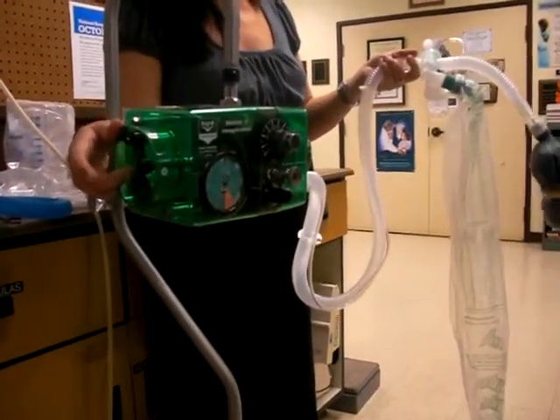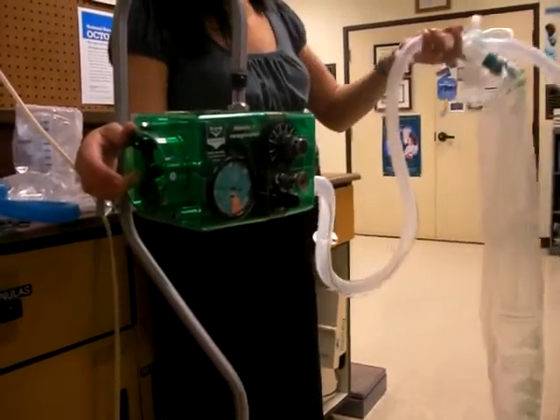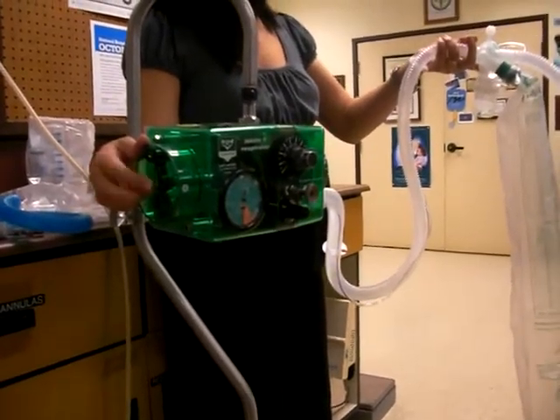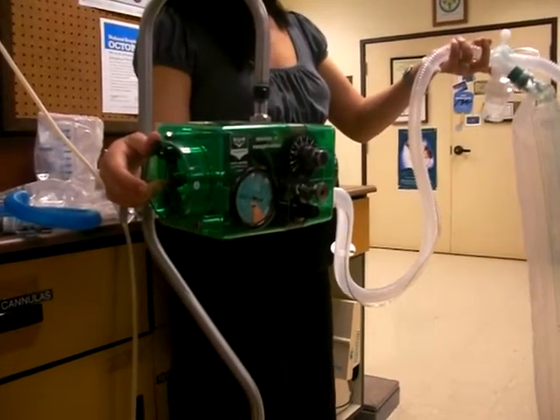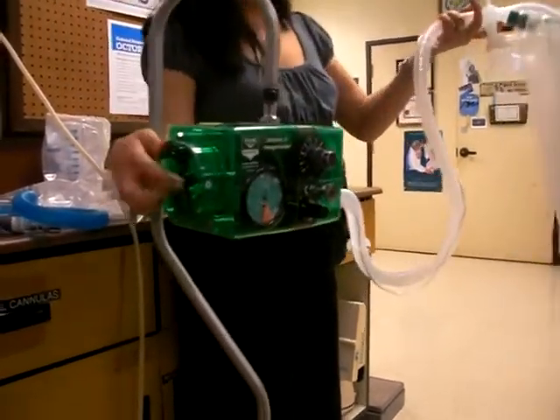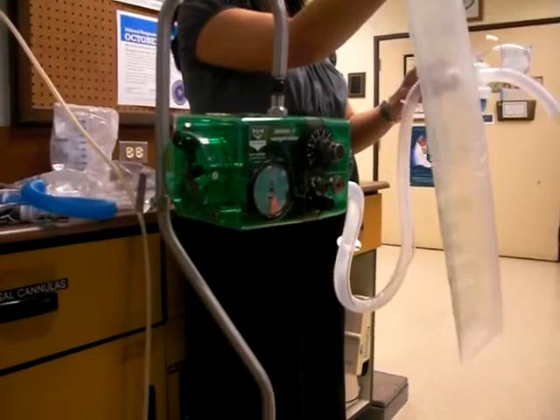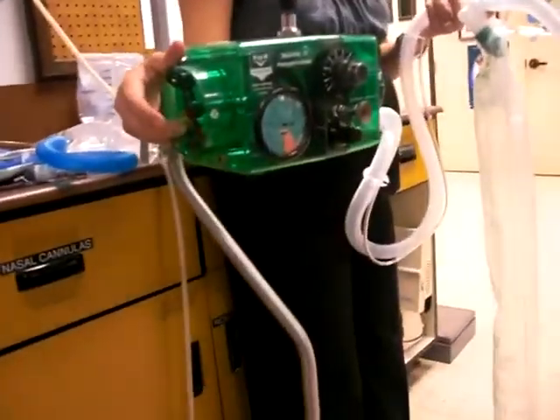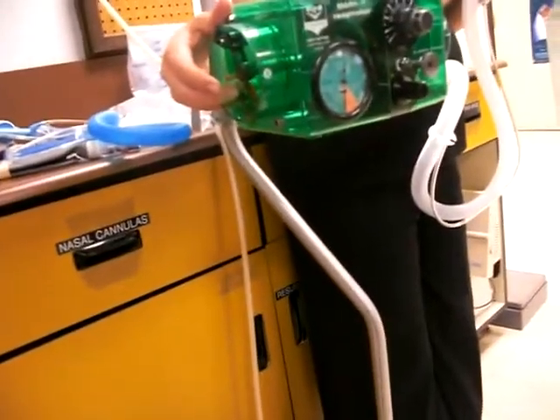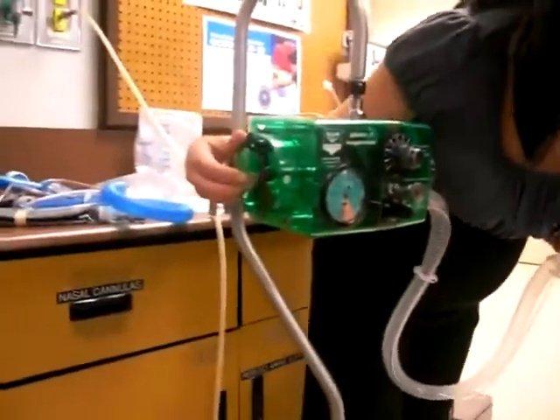2. Does it sound about 1 second? 3. 4. That's about 1 second. 5. 6. 6 to 7. So that's about 600 to 800. At what pressure was that, Jess? Did you notice? No, I didn't. Oh wow. It's like 20. Yeah, 30. 30? Okay, about 30.